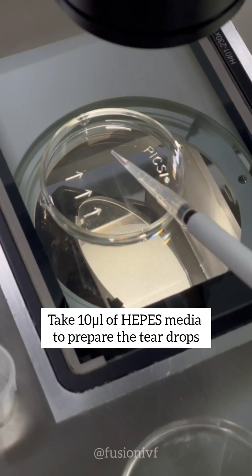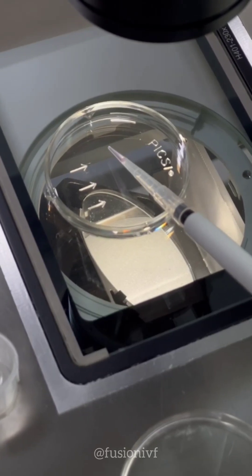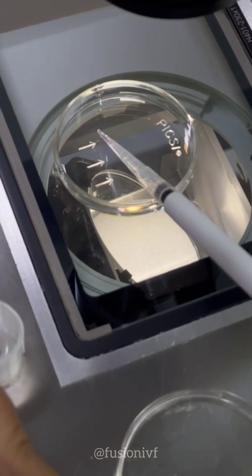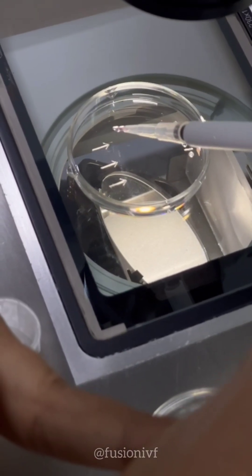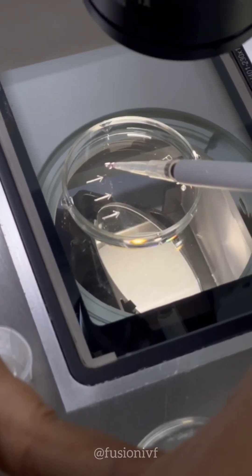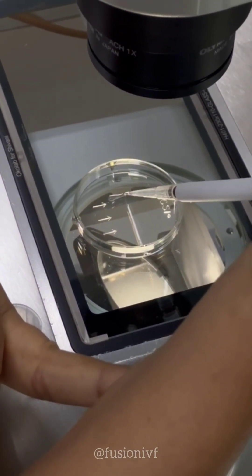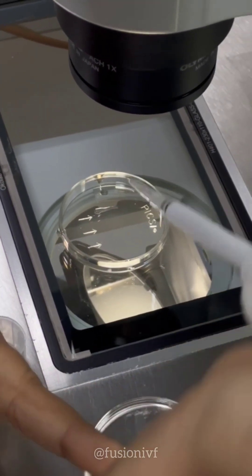You can put the sperm sample on the other end and they will swim up and come to the hyaluronan drops — like this.